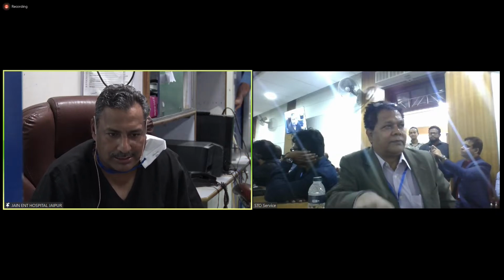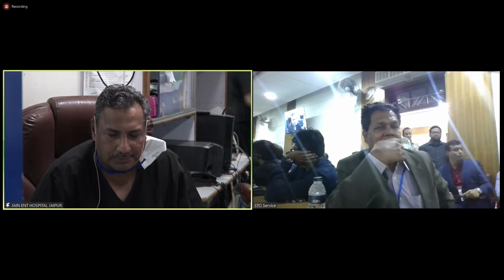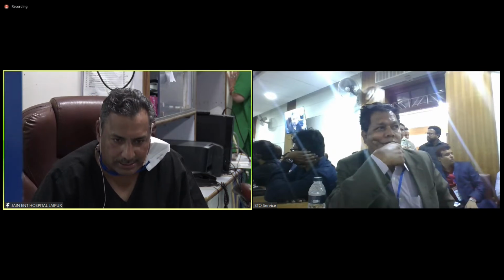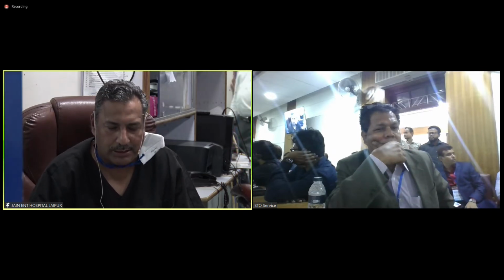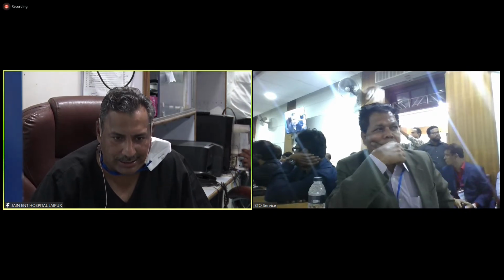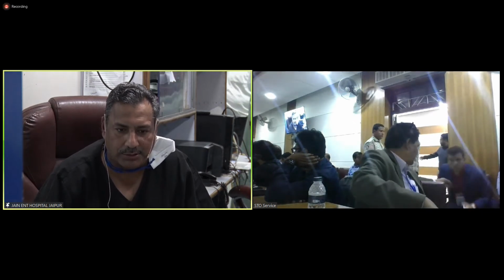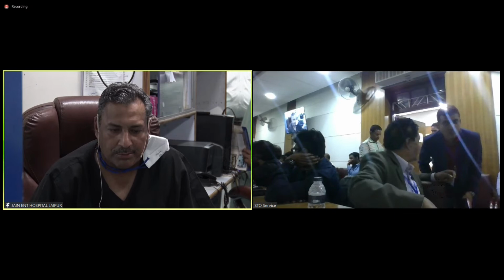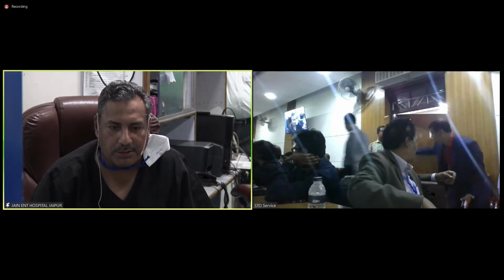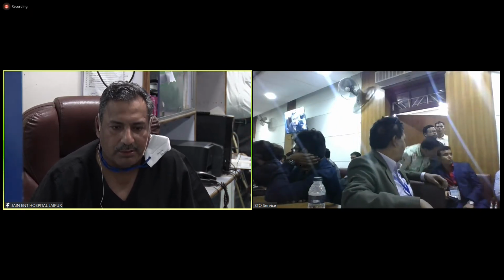For this 3 hour session on this very important day, the beginning of your conference, for this live surgical session and some presentations. I'll begin with some basic surgeries which I have not done in Bangladesh earlier. I have been there a couple of times and did some sinus surgeries, angiofibroma, tumors and other things. But this time I am connecting with some basic surgeries from our theater, which we come across in our practice almost every day.